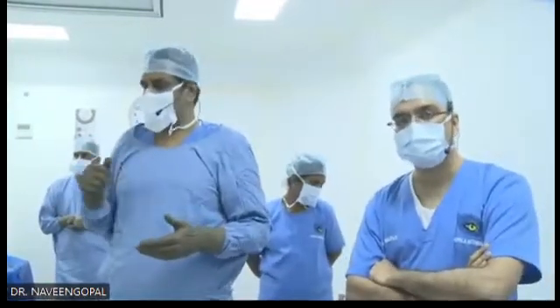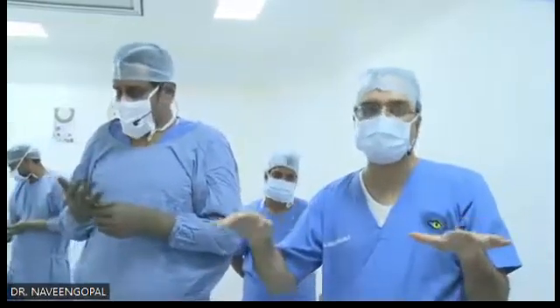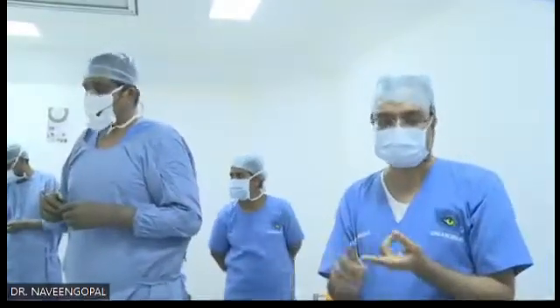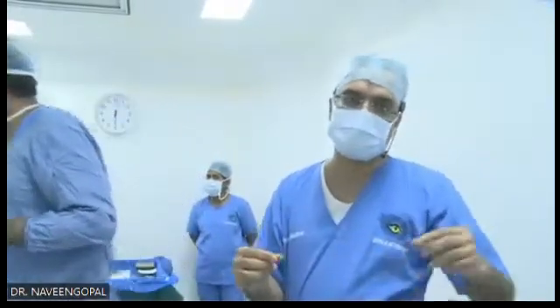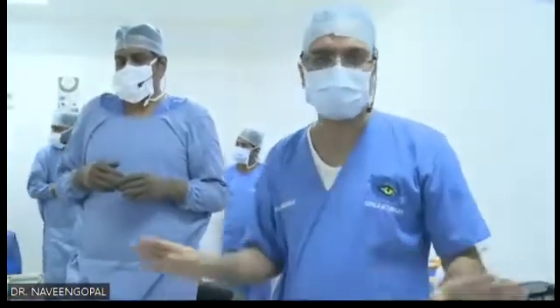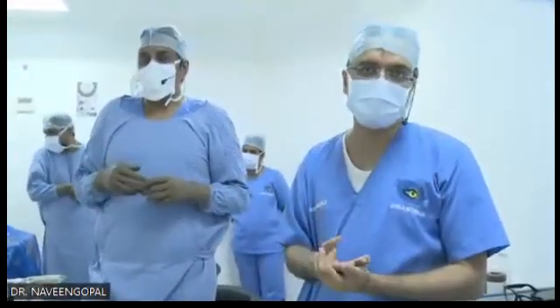It's very easy. One more thing: you see star ICL versus these acrylic phakic lenses. There are a few advantages. Number one, they give two lenses. Number two, they deliver very fast. Number three, you don't need any special forceps or instrument, whereas in star ICL you need to purchase it. For that itself they charge somewhere around 30 to 40,000. Here you don't need any extra instruments. Just your phaco set is sufficient to load the lens and do the surgery.